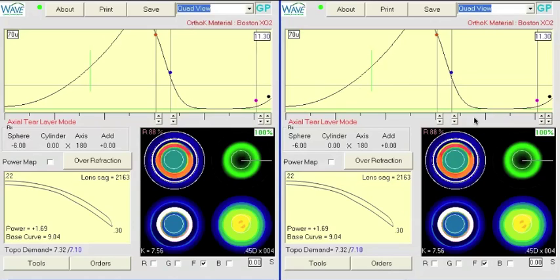Whenever a lens is moving laterally, I look to first make sure we're using the largest lens we can, and we're already at 11.3 diameter. It was an 11.4 cornea, so we cannot go any larger without going to a semi-scleral design, which I'm not going to do here.